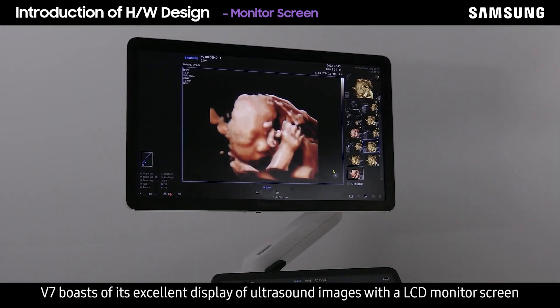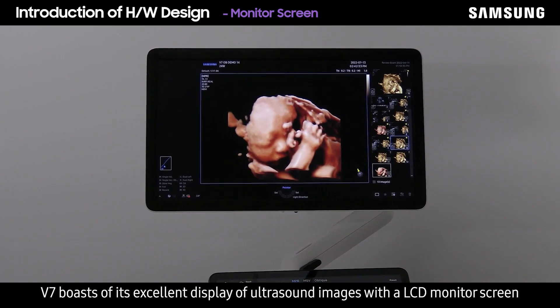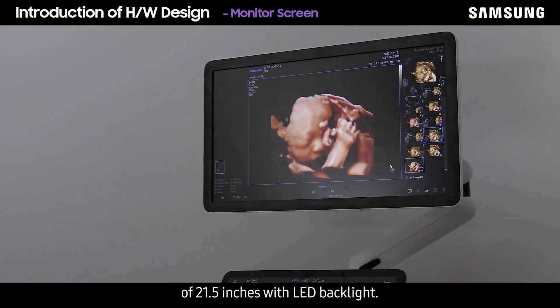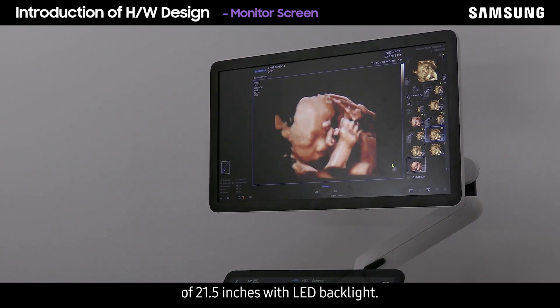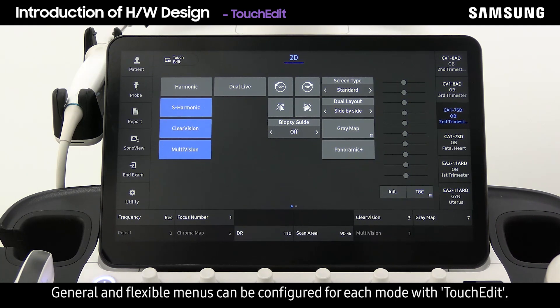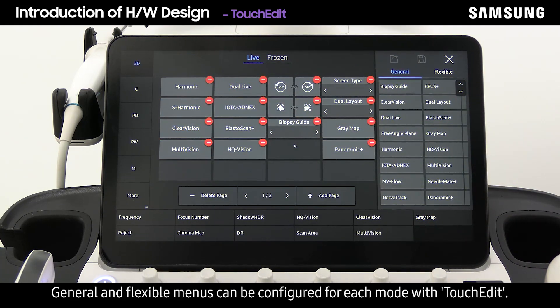The V7 boasts excellent display of ultrasound images with an LCD monitor screen of 21.5 inches with LED backlight. The system also provides a 14-inch touchscreen with high sensitivity. General and flexible menus can be configured for each mode with touch edit.